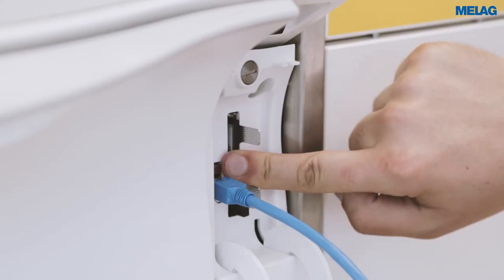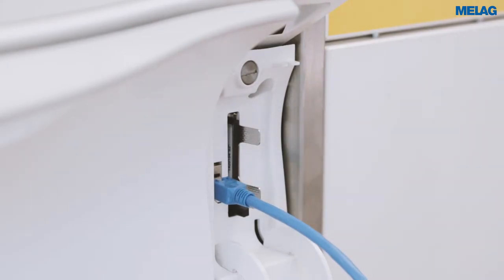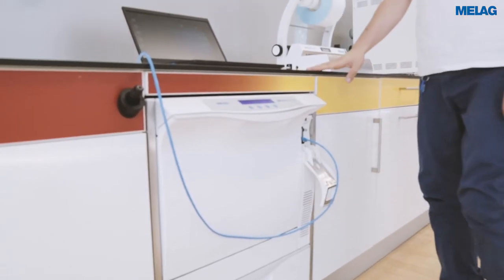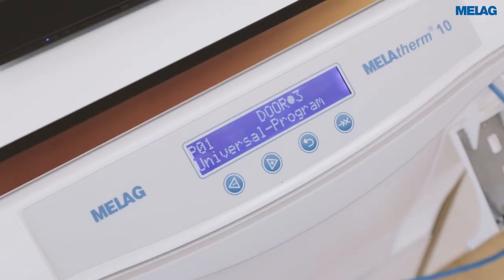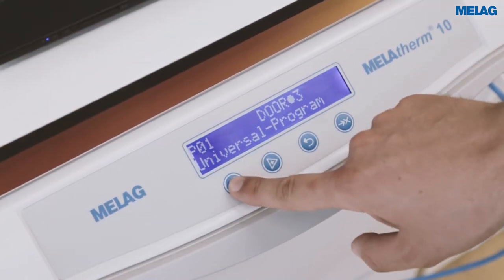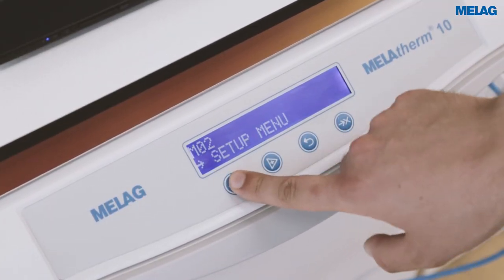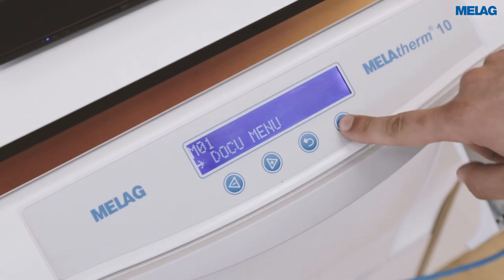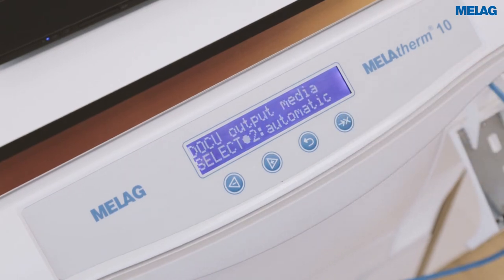To transfer log files from the MELAtherm 10 to a CF card or network, we need to enter the docu menu. To enter the docu menu, press the minus button two times, and if you see the docu menu, confirm it with the fourth button to the right side.